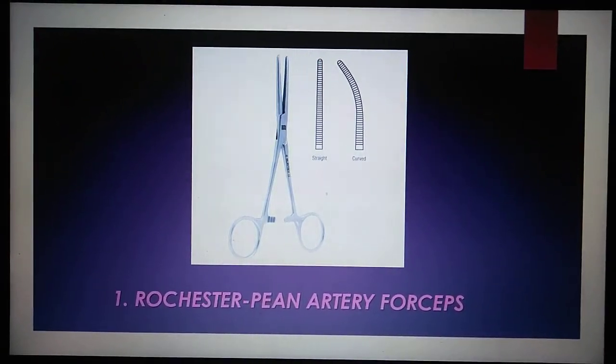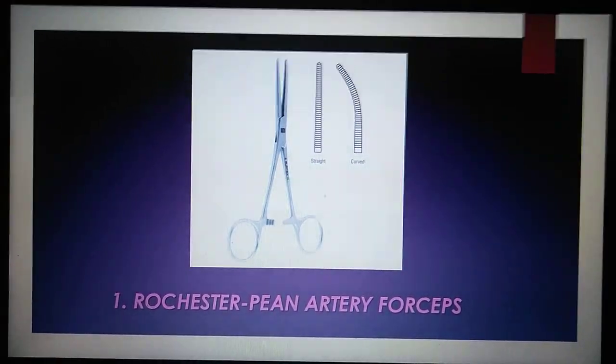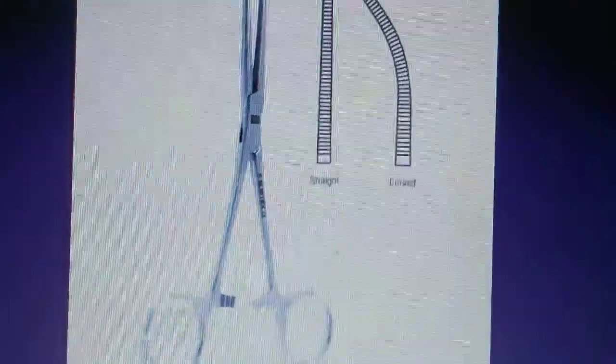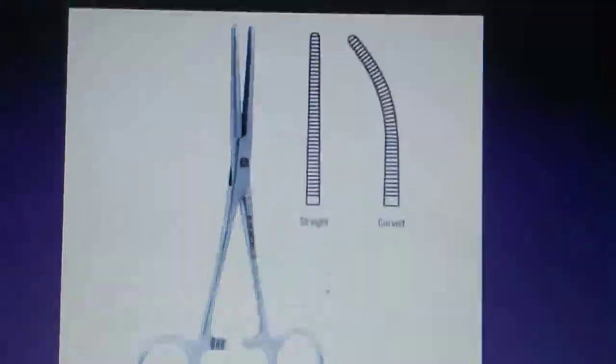Number one is the Rochester Pean Artery Forcep. The Rochester Pean Artery Forcep is used to clamp larger blood vessels and control blood flow.